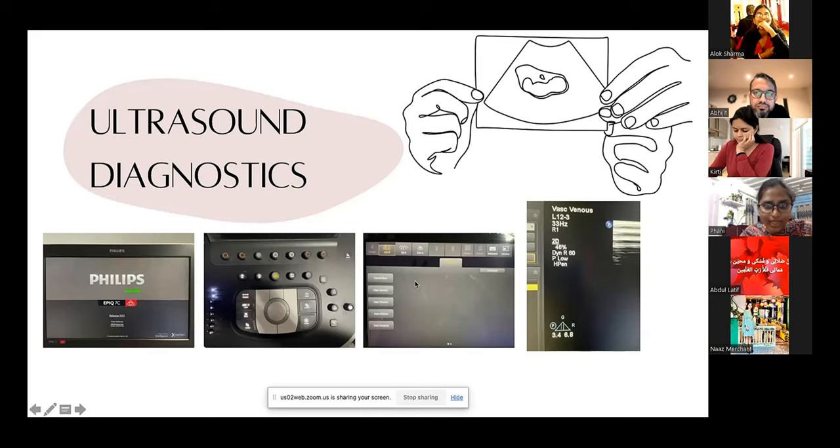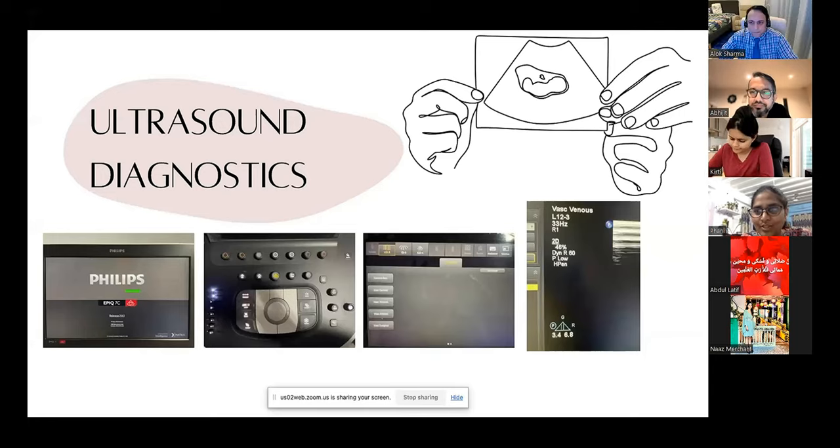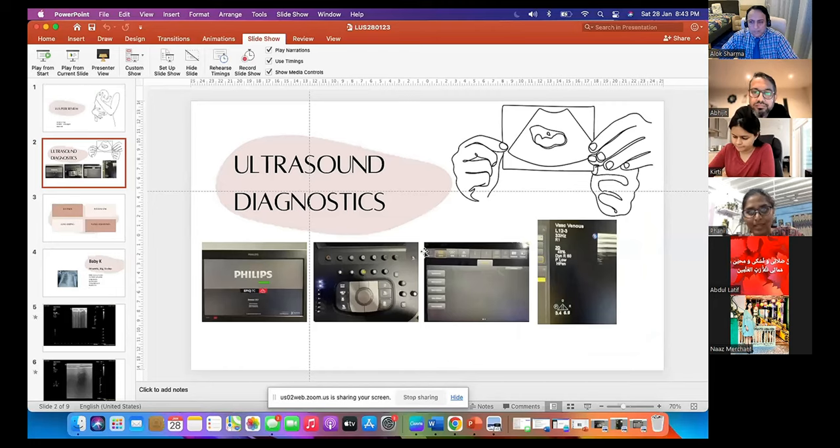And then I've used the probe, linear probe, L12-3, and it is a kind of adult size. So I've selected that probe, and then I could see only carotid artery, carotid general vascular, carotid vascular venous axis, which are there. So I didn't know which one to use. So I've used the vascular venous module I have selected. These were all settings which were set prior to this module.